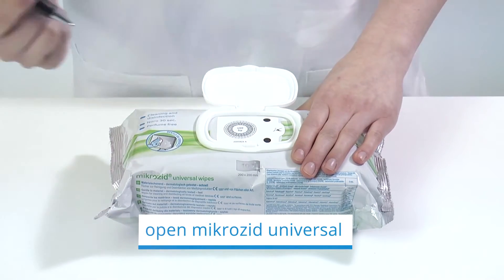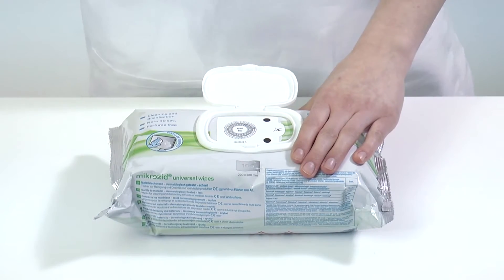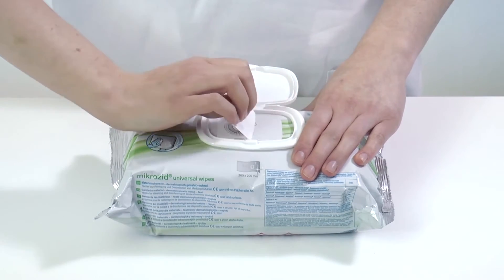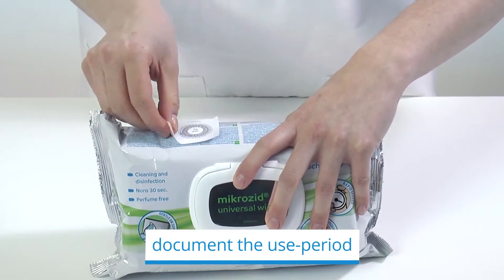Open mikrozid universal. A skillfully designed sealing label serves as opener. On the one hand, it ensures product stability. On the other hand, it can be used to document the use period or the expiry date.